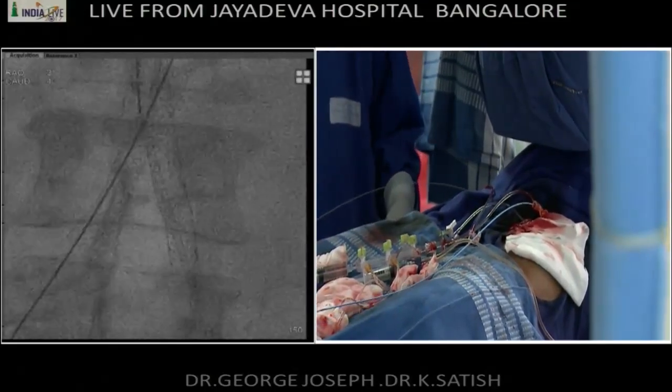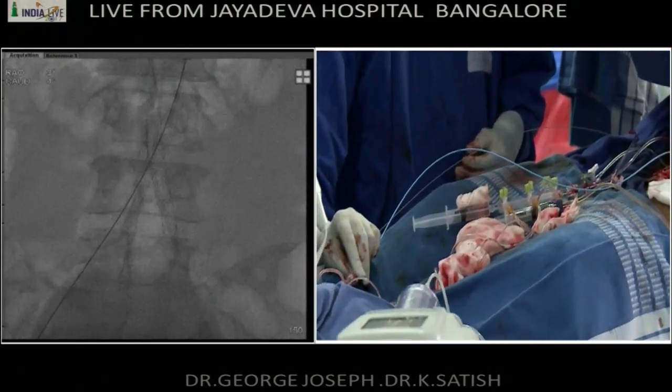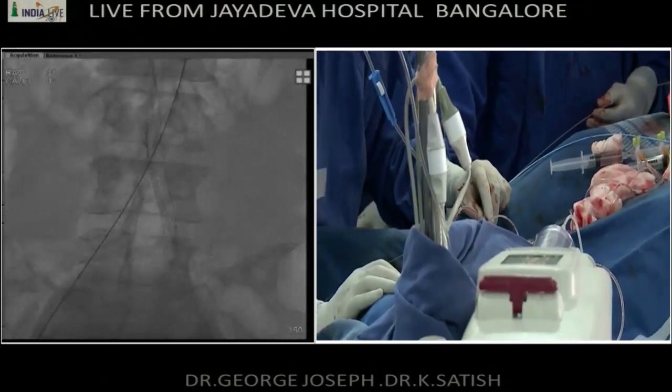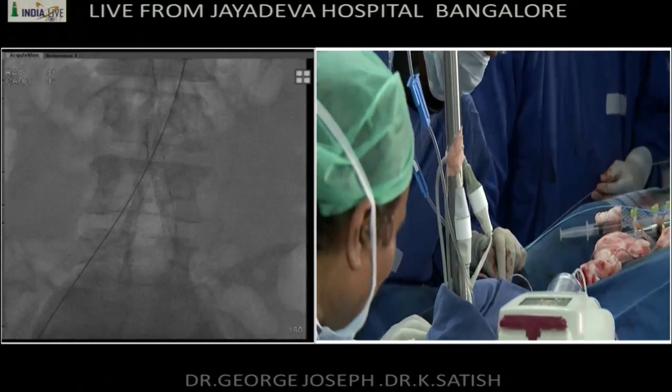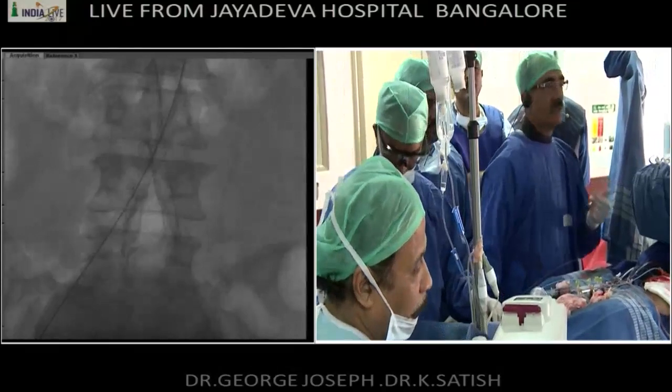He takes a self-expanding 14 into 80 or 100, and then from the aorta to the right iliac, and from the left iliac, cross it through the struts, and then put the balloon expandable stent, just 2 millimeters inside the previous stent. Okay, we'll have to tell him to breath hold.